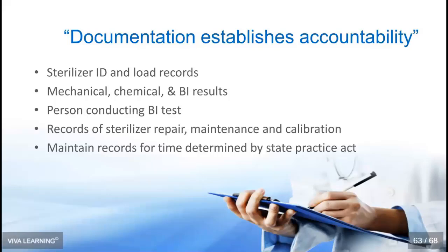Also, in that logbook, when you do any type of sterilizer repair, maintenance, or calibration, it's a great idea to include that in your BI log, because then you have a complete history of that particular sterilizer's health, so to speak. And the question that I often get asked is, how long do we need to retain these records?